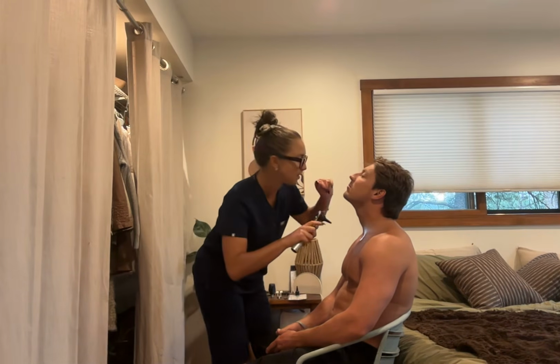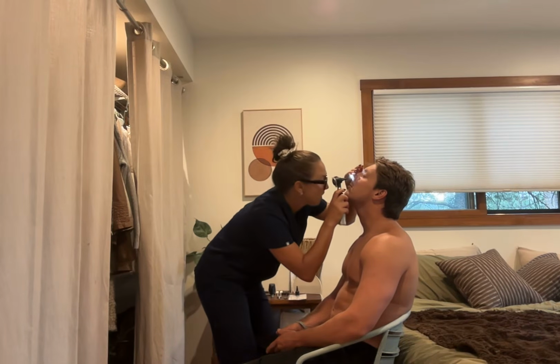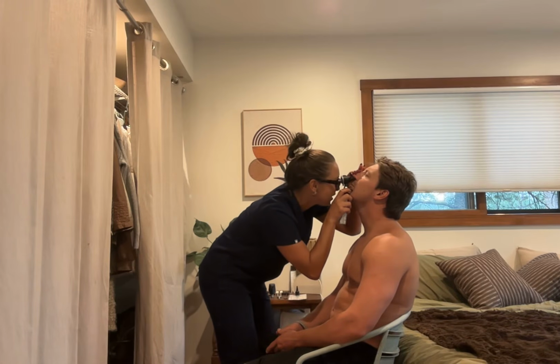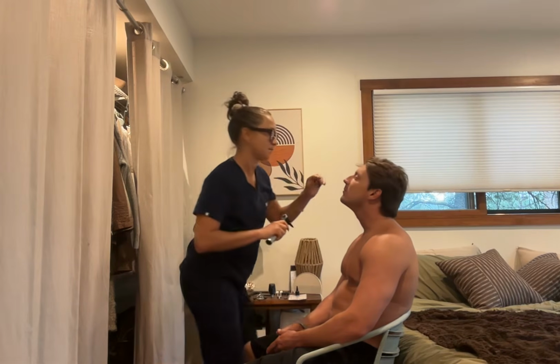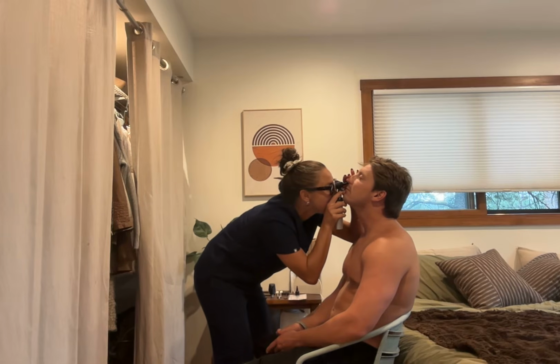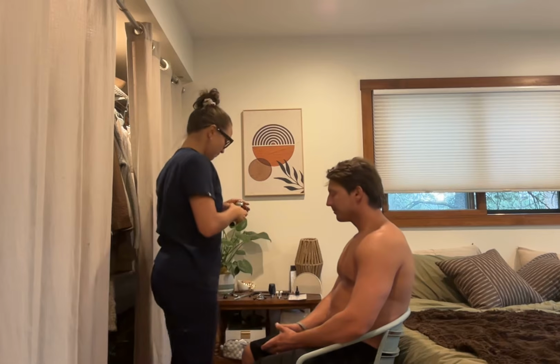So I'm just gonna bring this into your nostril, just a little bit of light. Should just feel like a little bit of pressure. Good. It is cherry pink, moist, little bit of drainage, turbinates able to be seen. Good. And I'm going to do the other side. Again, no obstruction on either side. Cherry pink, scant drainage, and turbinates able to be visualized. Good. Okay.